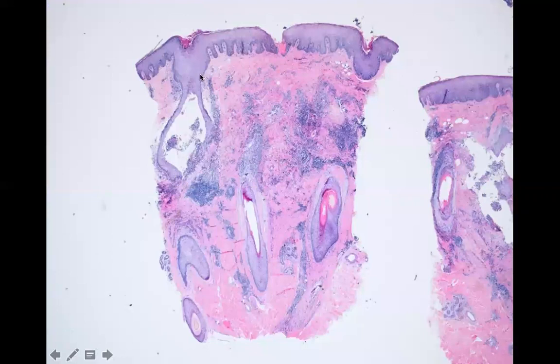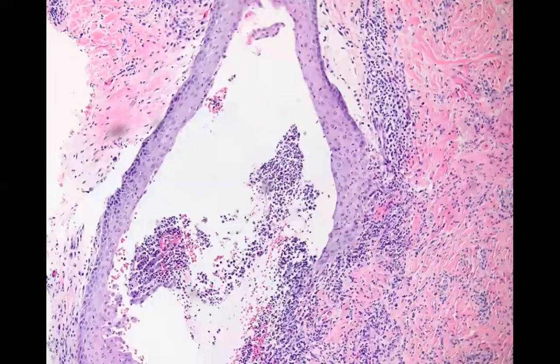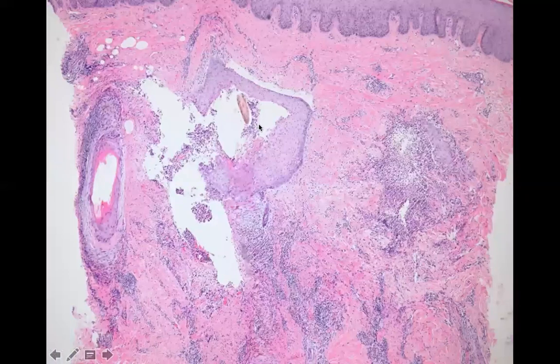Here's a follicle, and it's very inflammatory, and it's not lichenoid with only lymphocytes the way LPP is. It is neutrophils in the follicle, okay? You might even be able to see staph with a Gram stain in the follicle, and then the follicle is destroyed, and it gets very inflammatory. As it's destroyed and your hair shaft is exposed, your body's going to mount an inflammatory response to close it up, and you're going to get all sorts of scarring in between, true scar. That's why in folliculitis decalvans you see real scars.